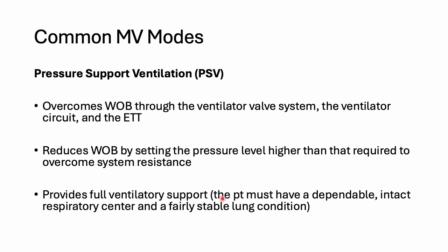Okay, but in this case, because we've mentioned before that this is a spontaneous breathing mode, the person must have a dependable, intact respiratory center. So the person must be able to breathe spontaneously, in other words, initiate their own breaths, determine how fast or how slow they breathe, and also how big or how shallow they breathe. But when you add more pressure in terms of pressure support, then the patient can actually breathe more deeply, and therefore it can also be used to help support ventilation.